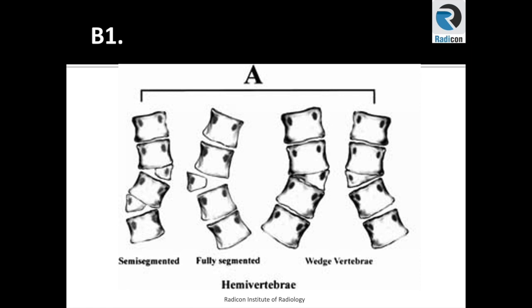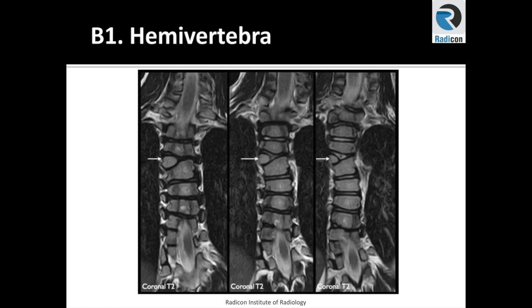Please make sure that there is no developmental anomaly such as a segmentation or fusion anomaly — for example, hemivertebra. Most of these anomalies will result in certain alignment disorders. A coronal view of the cervical spine demonstrates a hemivertebra. You can see the disc space above it; however, the inferior disc is not fully formed, so that appears to be a partially segmented hemivertebra resulting in an alignment disorder.